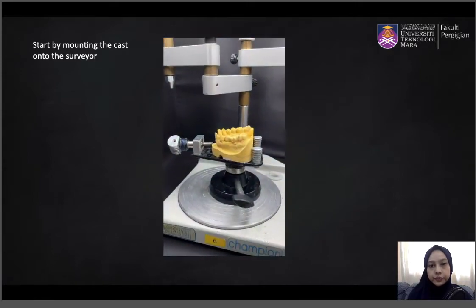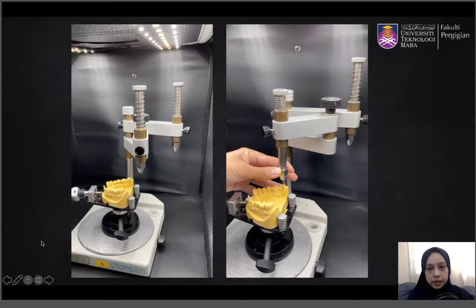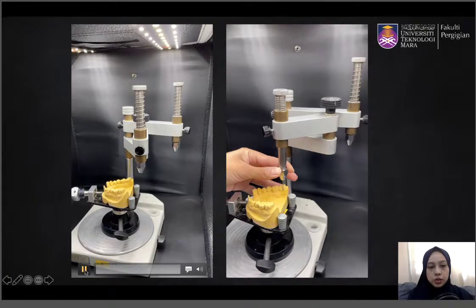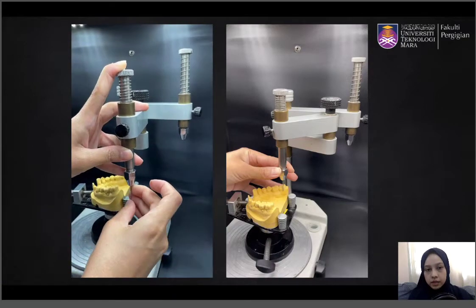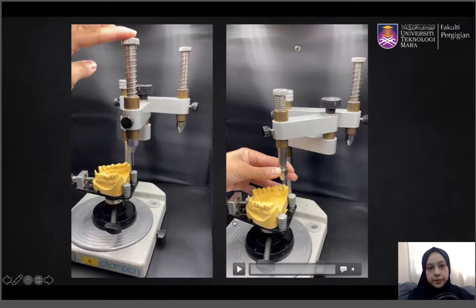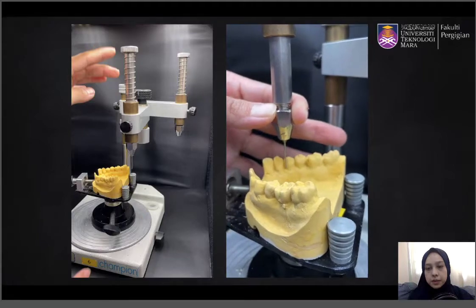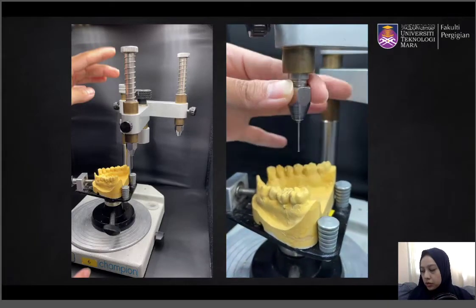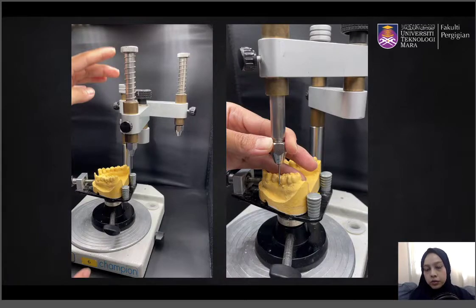Lock the tilt. Next, you want to analyze the cast using the analyzing rod. Start by fixing the analyzing rod onto the tool holder, then run it against all the teeth, especially the abutment teeth. You want to observe the triangular undercuts to see if there are spaces available below the height of contour, to ensure you get the most desirable tilt before beginning the survey.